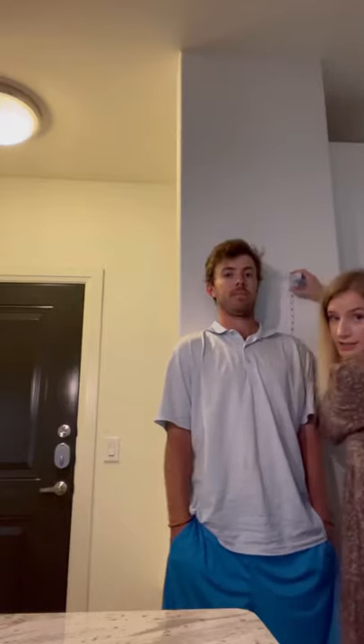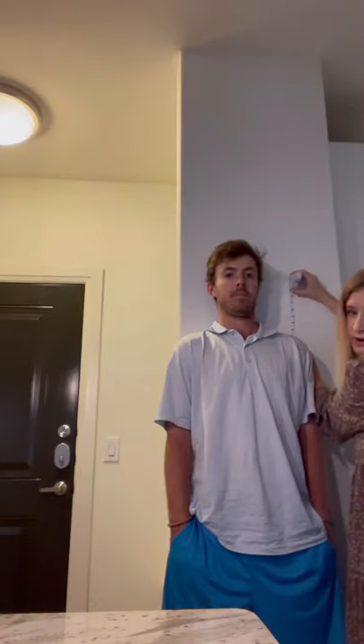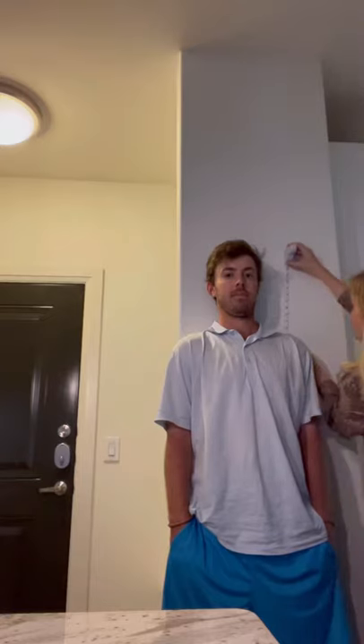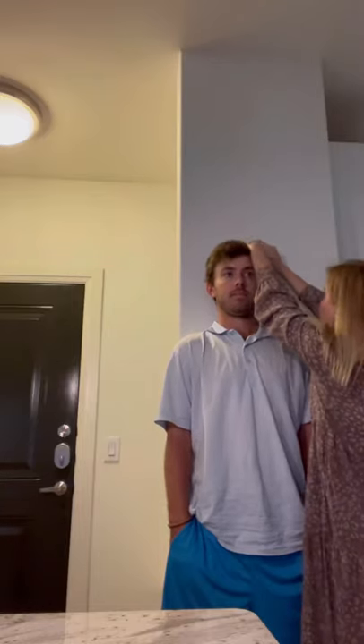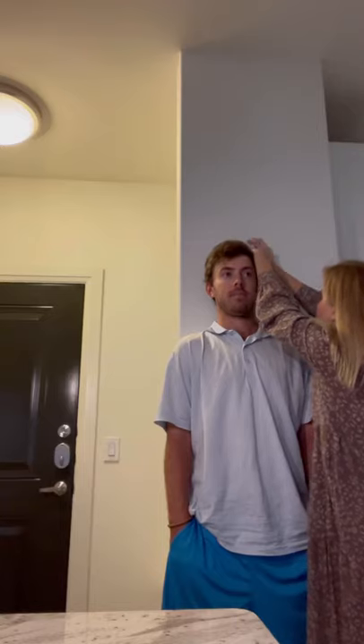This is obviously not the most accurate way — normally the stadiometer is the most accurate way. But it looks like he's right at 72 and a half inches. That sounds accurate. Okay, so that's how you do that one.